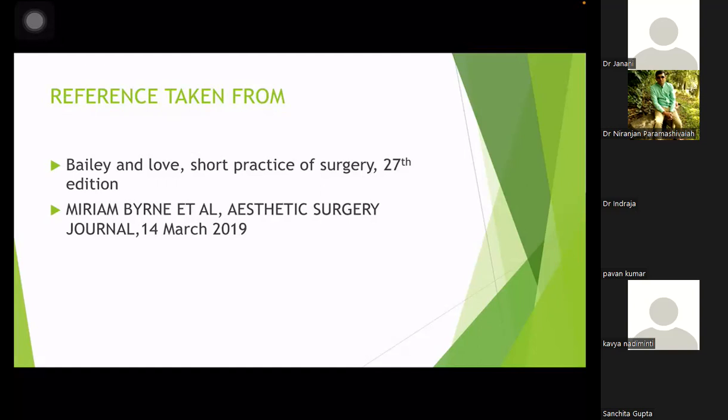That gives you the best result. The suture length has to be about 3.5 to 4.5 times the length of the wound. That is usually recommended when you are doing closure for a very bad peritonitis or dehiscence. If there is a complete dehiscence or burst abdomen, then you are well advised to put interrupted sutures.